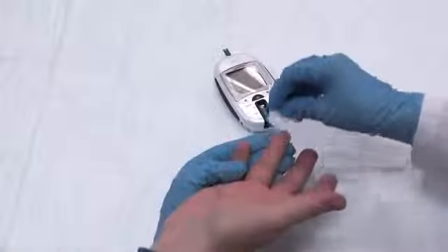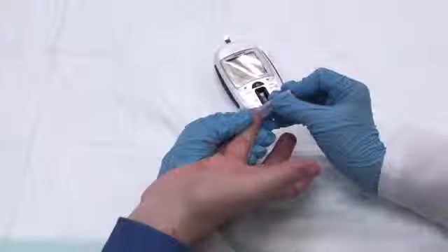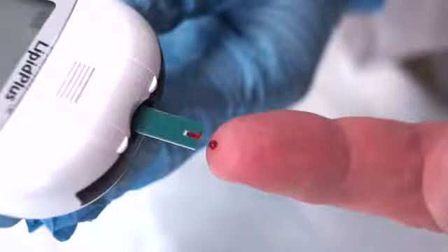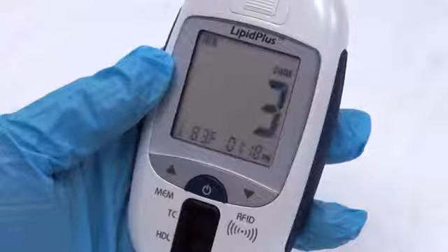Testing. Wipe the finger with an alcohol swab and allow to dry. Lance the finger with a disposable single-use lancing device to obtain a blood sample. Then apply the blood sample directly to the test strip confirmation window until it is completely filled. The blood symbol will blink when the analyzer is ready for the blood sample. After the sample is applied, the analyzer counts down from 3 to 1 while testing is in progress. The analyzer then displays the test results.